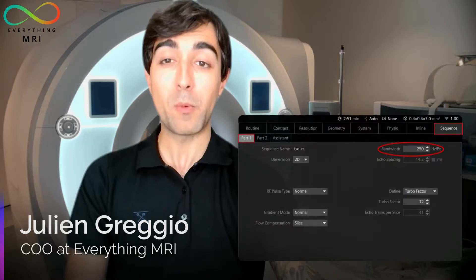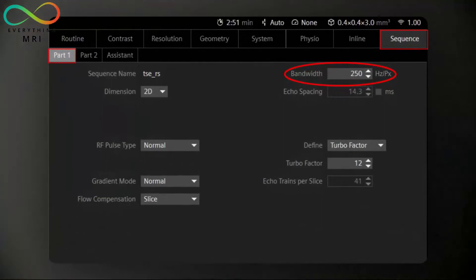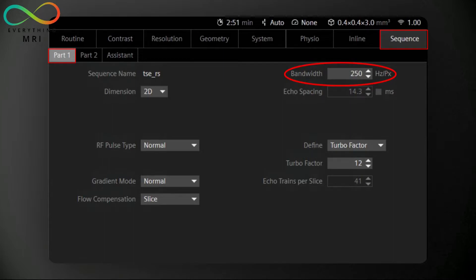Where can we find the bandwidth? In Siemens scanners, the bandwidth is located in the sequence tab under Part 1 — you can see it at the top right part of the screen. The scanner we are using is a 3 Tesla scanner. It's worth mentioning that at such a high magnetic field strength, a reduction of the bandwidth would bring a chemical shift increment roughly twice as high compared to 1.5 Tesla. Generally, most turbo spin echo sequences at 3T are saved with a bandwidth of 250 Hz/pixel, while at 1.5T this usually ranges between 130 and 190 Hz/pixel.